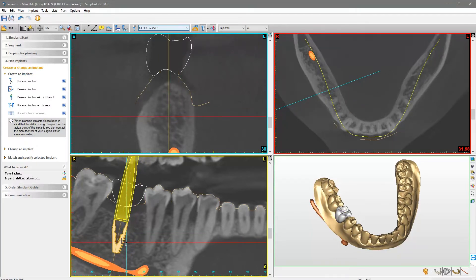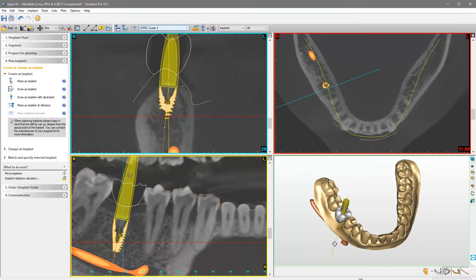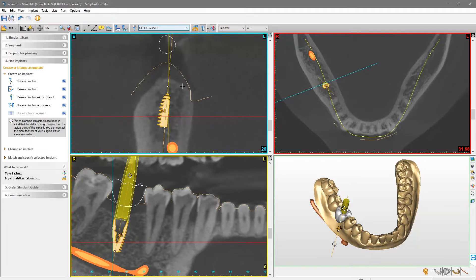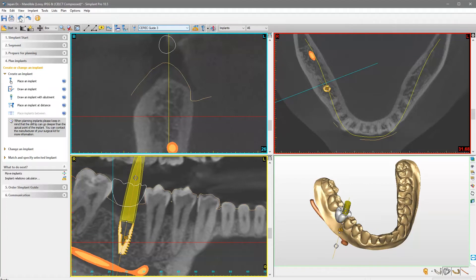Again, we drag and drop the implant and scroll through the cross-sectional view. At any time, you can undo any of these actions by clicking the Undo icon or pressing Ctrl-Z on your keyboard. Next to it, you will find the icon to Redo.